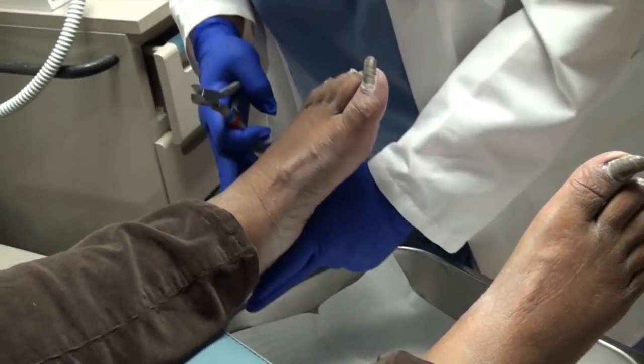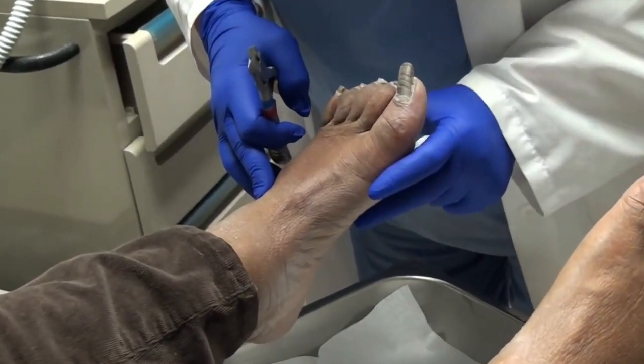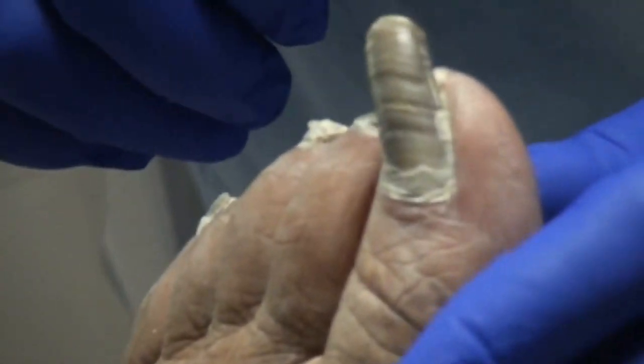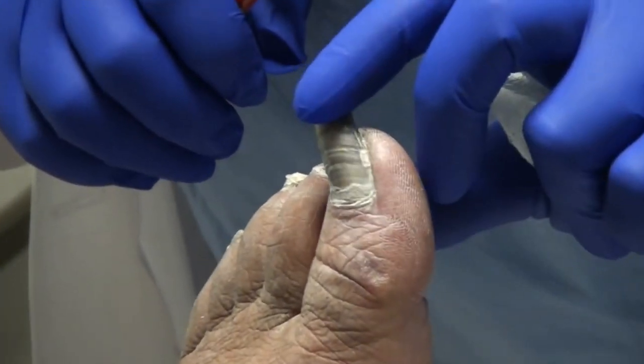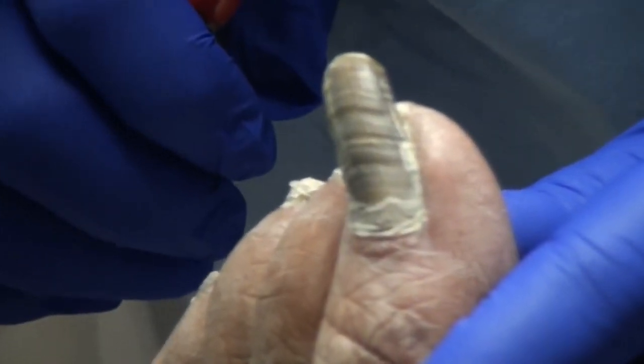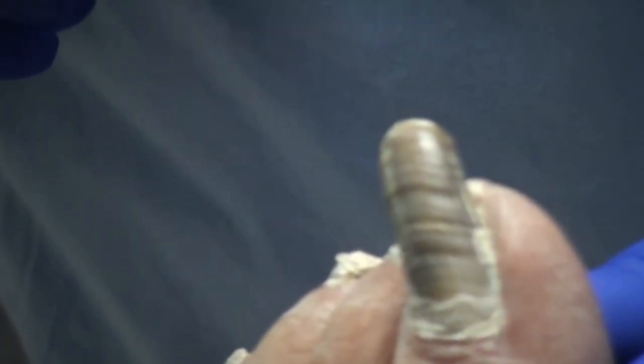So what we're going to do is I'm just going to trim all of these. And with the big toes, my challenge — those are beautiful, by the way — my challenge is cutting them straight across.